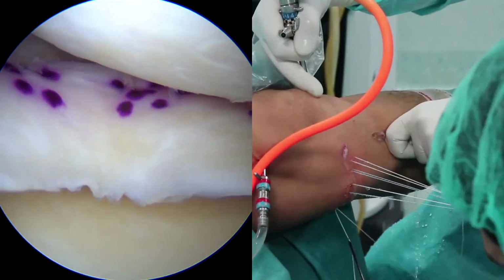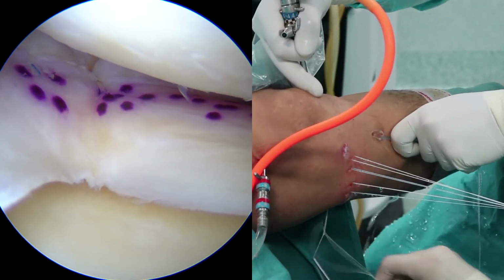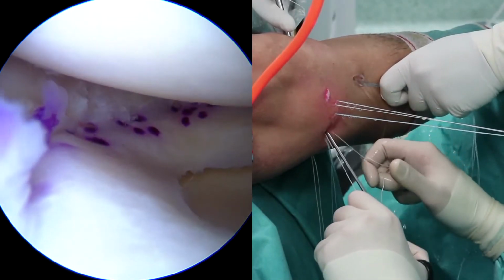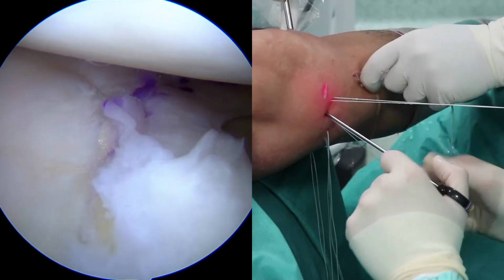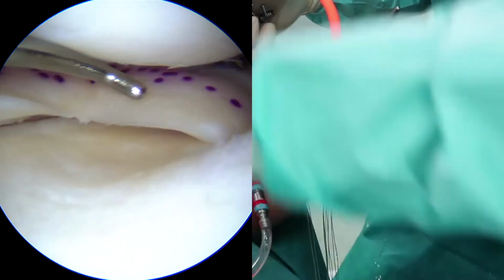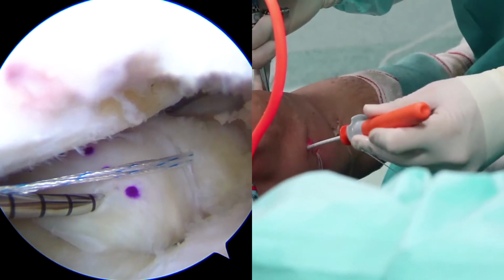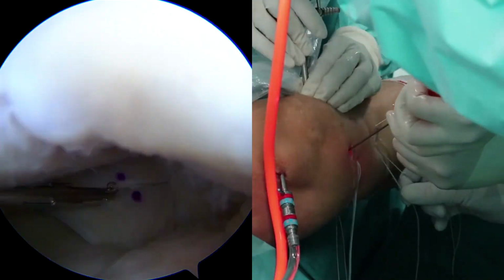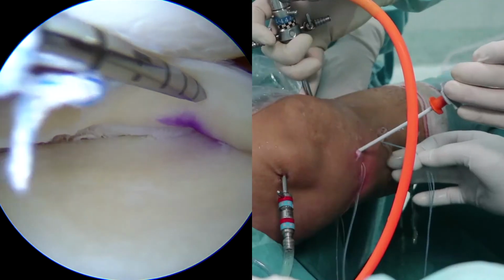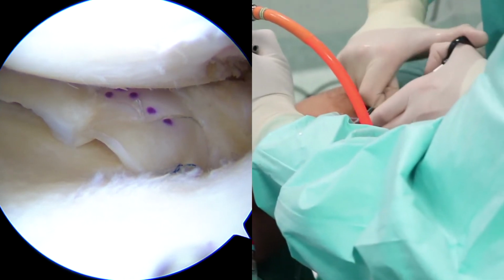The sutures extracted from the body and the anterior aspect of the graft are then firmly attached to the capsule, with care not to trap subcutaneous fat tissue or any terminal branch of the saphenous nerve. As these sutures are normally deep because of the swelling, a knot pusher can be very useful to do this maneuver conveniently. The posterior horn area, which has received only one suture at this point, is reinforced to the posterior capsule using all-inside sutures, normally 3 or 4 of them, both in the upper and lower region of the meniscus.